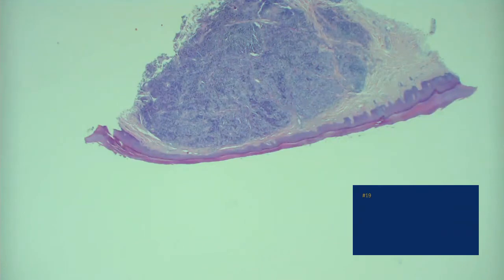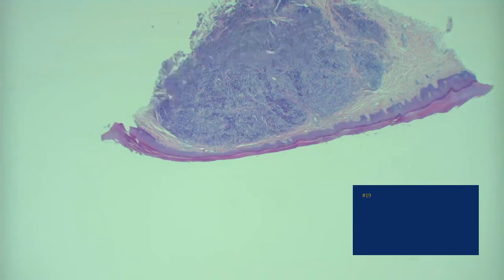Switch back to the standard. Yeah. Okay, that's fine. So did you think it was an inflammatory or a neoplastic process? I thought it was an inflammatory process. Okay. There seems to be a collection of inflammatory cells. Now, these are inflammatory cells. What kind of cells did you think they were? I mean, lymphocytes, histiocytes, neutrophils?